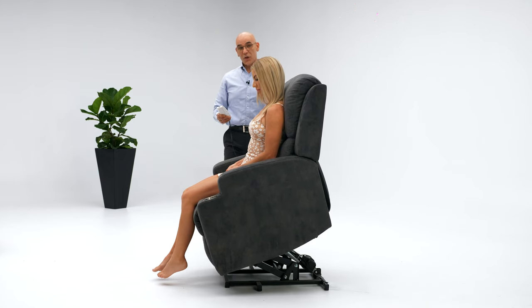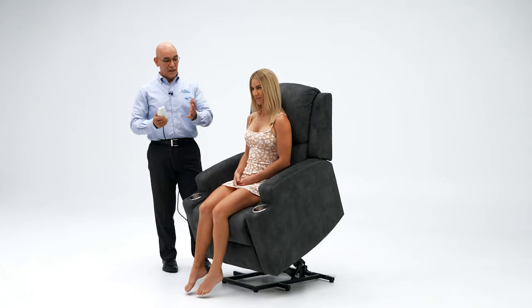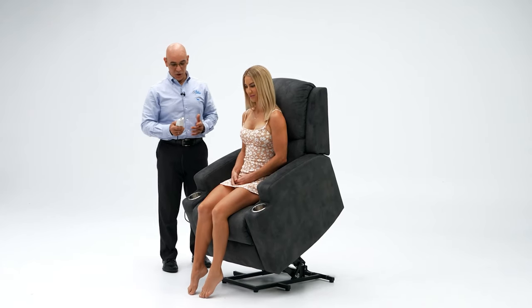Using the lift mode will bring you to a nice, almost upright standing position so you can easily get in and out of the chair.